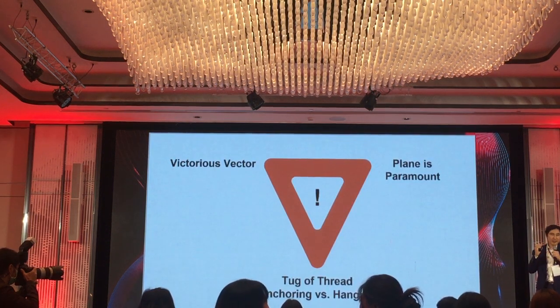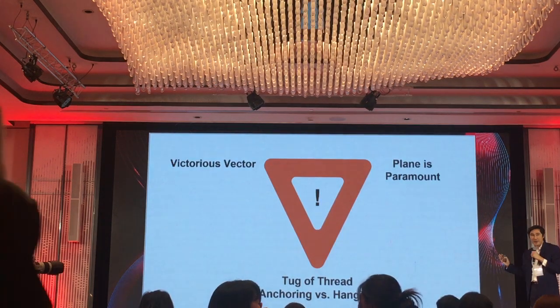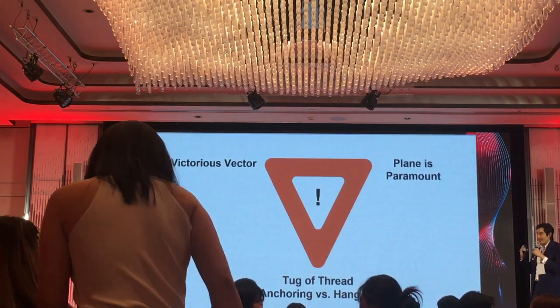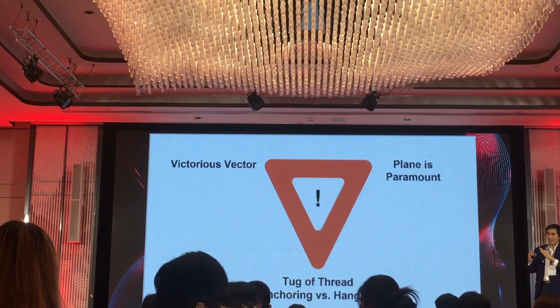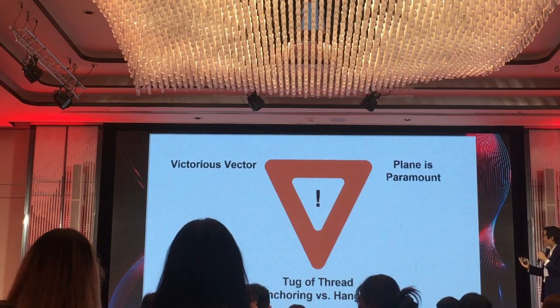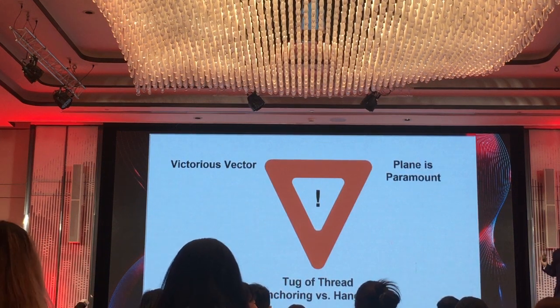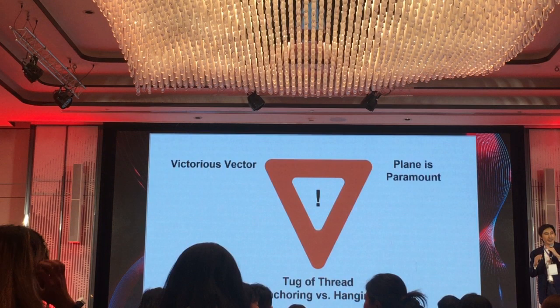If we want to do thread lifting that is effective and safe, we should consider three major factors. The vector will decide the beauty of the result, whether it is good or not good. After you decide the vector, next you consider the plane, because the result will be different depending on the plane in which we insert the thread.